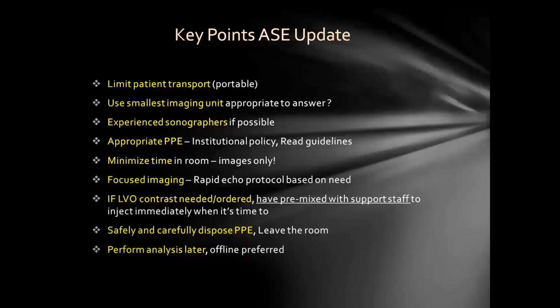As I've mentioned, safely dispose of your PPE. Any analysis you should be doing later, whether it's offline software at the workstation, which is probably preferred because it's not the actual equipment, or certainly on the equipment, then after you've terminally cleaned yourself, the equipment, and it's been removed from the room and is in a safe area.